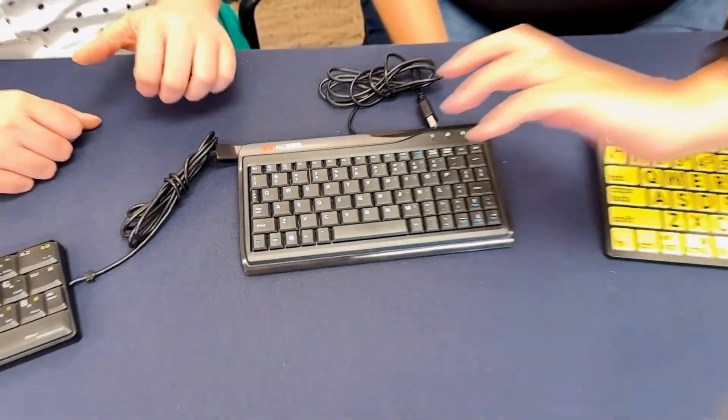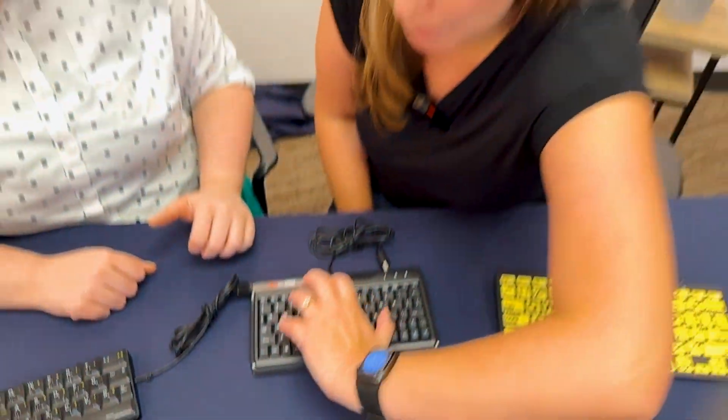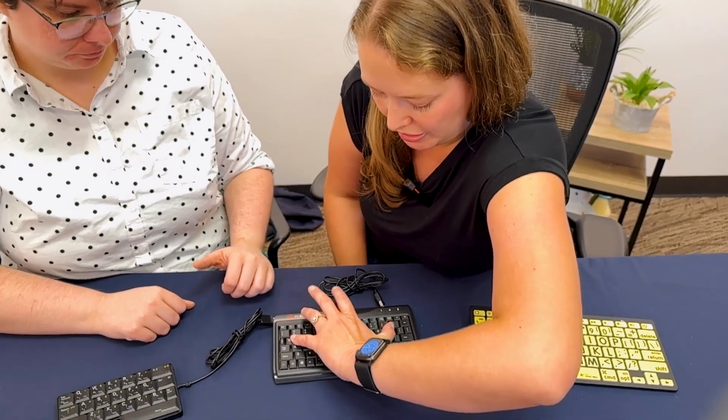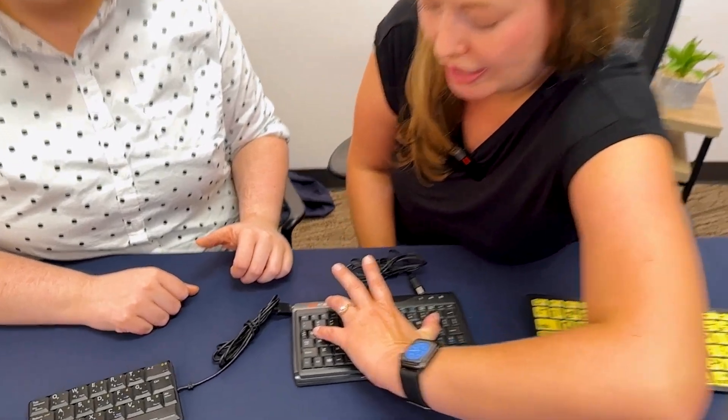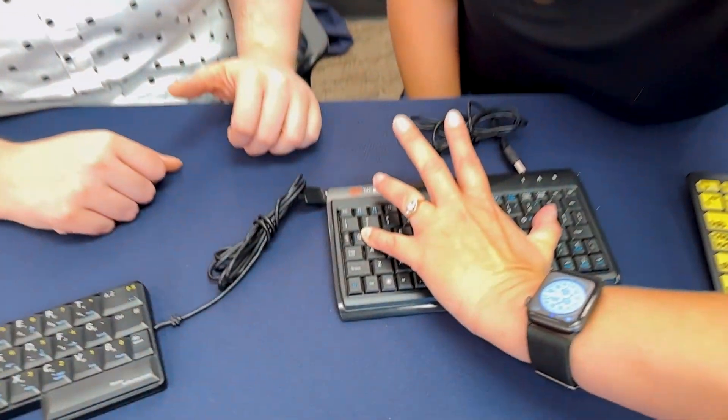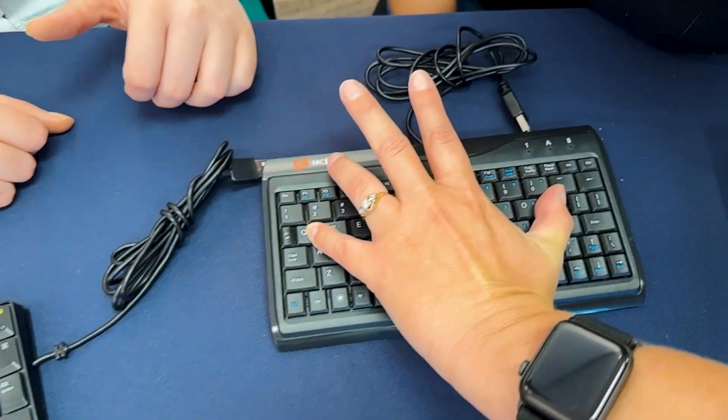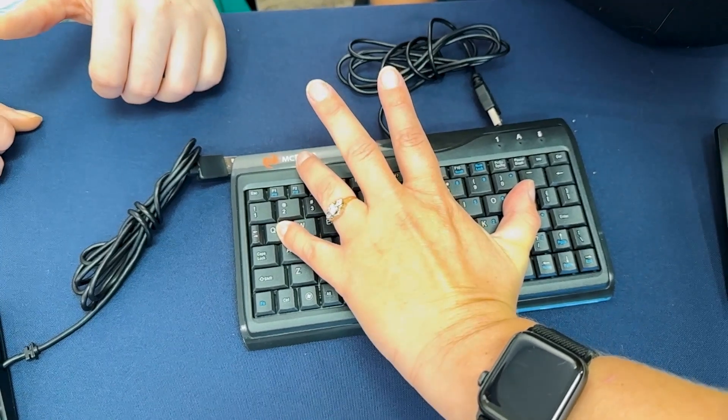Even if you have a small hand, you can reach from Q to P with one hand, and my hands aren't all that big.